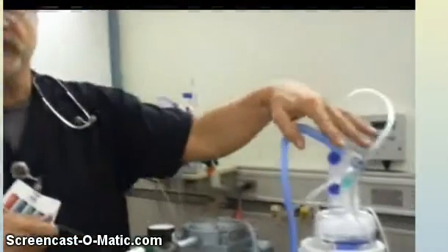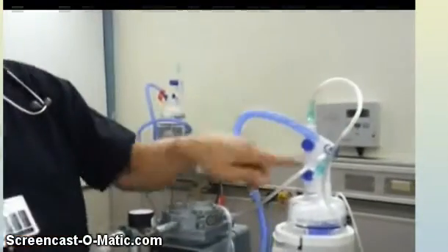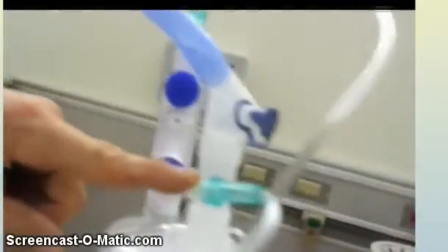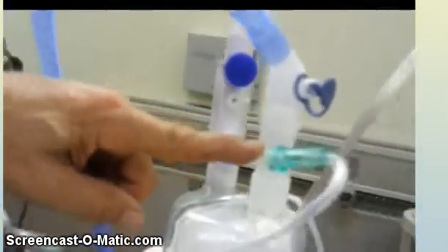The other system splits off, goes to this system, and the one difference is here we have an inlet where we can bleed in an oxygen gas source. By using a table of air oxygen ratio, we can tell you what the FiO2 will be. The FiO2 will be mixed in this chamber. It'll come out here and be delivered to the patient.